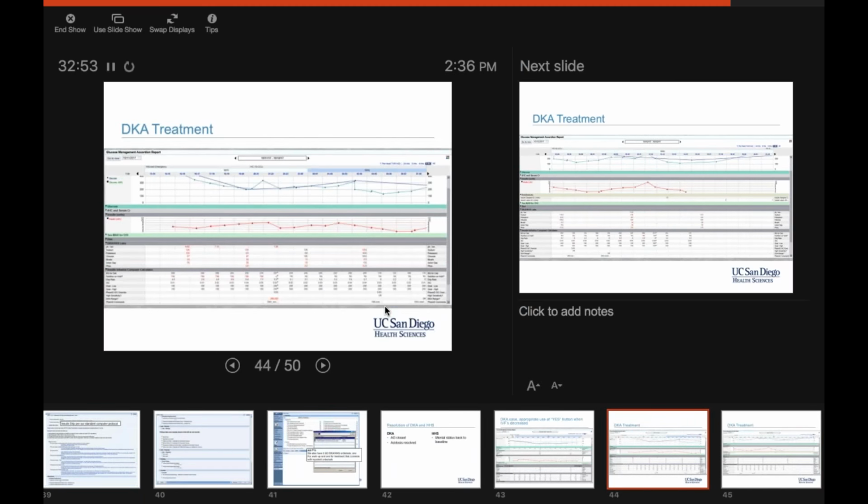Okay, so here's another example that came up. This is a patient with type 1 with DKA, came in, met all the criteria, blood sugars really high. Fluids, electrolytes, and insulin were started, dextrose was started, and we're running here. And then somebody decided to press the button, the 200 to 250 button.